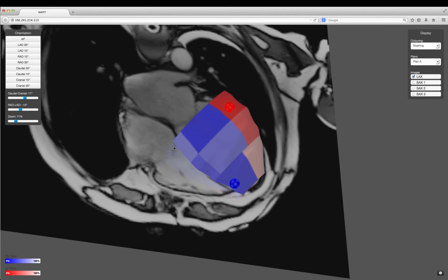For example, the tricuspid valve leaflets are shown here. Our RV target is quite distal. If you want to use the tricuspid valve leaflets as a reference, it may assist you in positioning a more basal RV pacing position.